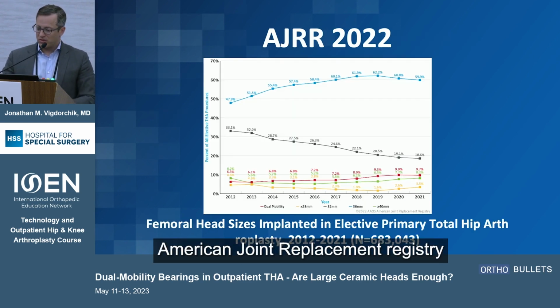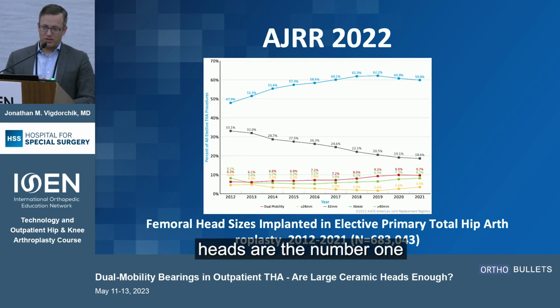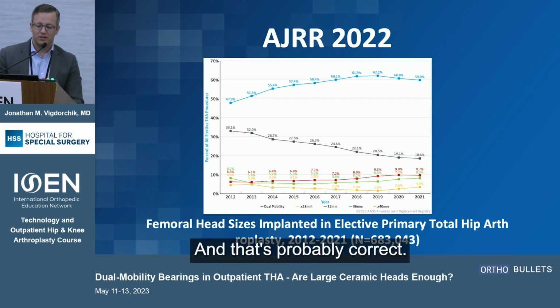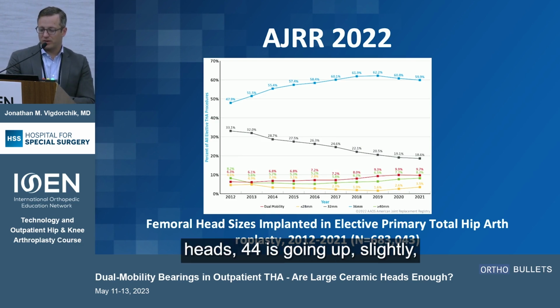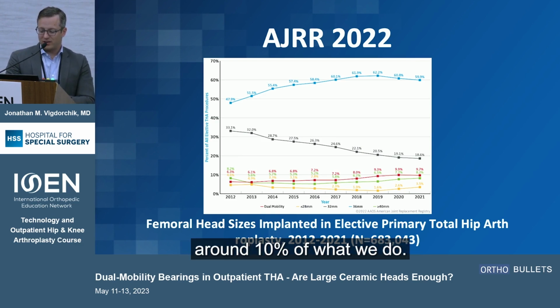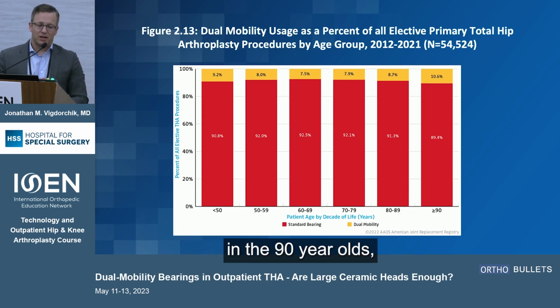American Joint Replacement Registry, dual mobility use, slight uptick. Still, 36 millimeter heads are the number one most common bearing, and that's probably correct for what we should do. 40 millimeter heads, 44 is going up slightly, but dual mobility is hanging out around 10% of what we do. When you break this down by age, it's a little bit higher in the 90-year-olds.